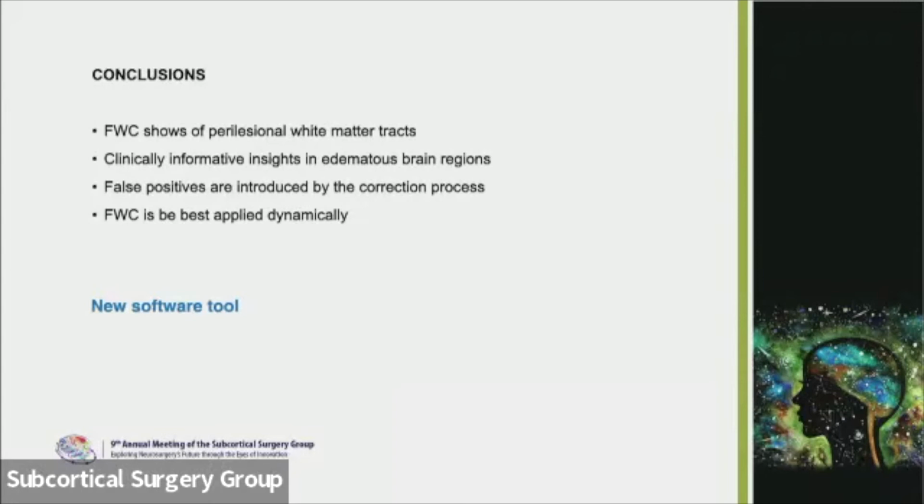I believe it's useful to conclude this talk with saying that quantification is important, measuring is important, visualization is important, and we will not get there unless we get these scans. And so I encourage you to use tractography where possible. The algorithm is automated and it doesn't add very much time to each case.